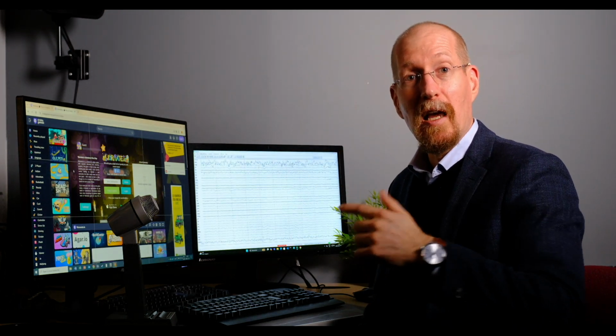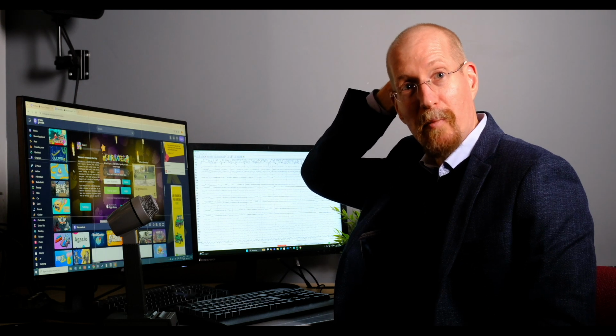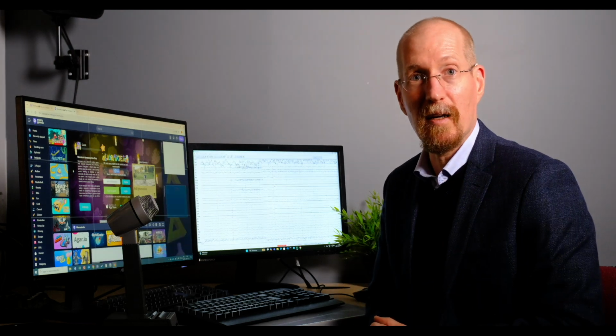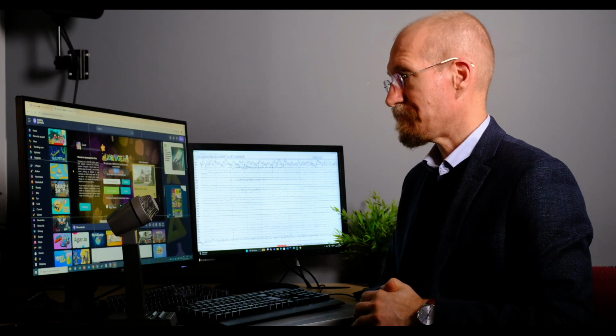That's very important because, as I showed you earlier, if we're going to be interested in targeting alpha frequency, for example, well, alpha ends up being most strongly shown in the posterior and occipital positions. So the last thing we want is to create a lot of muscle tension that interferes with this signal. So making sure the participant is in good posture and relaxed is very important.